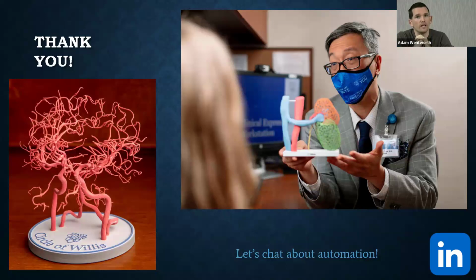Yeah, so the lower extremity also includes arterial phase. And largely this is tied with CMF for fibula free flap operations, so that we need fibula bones included in that. So that speaks to what applications do you do first? It's the ones that you do the highest volume of, or that are most tedious to do manually. So spine is super tedious to do manually, and CMF for us is a large volume. I would say that the CMF and lower extremity are things that are still in development, but are still useful to us.